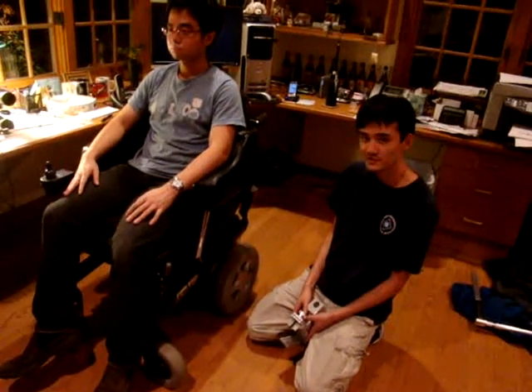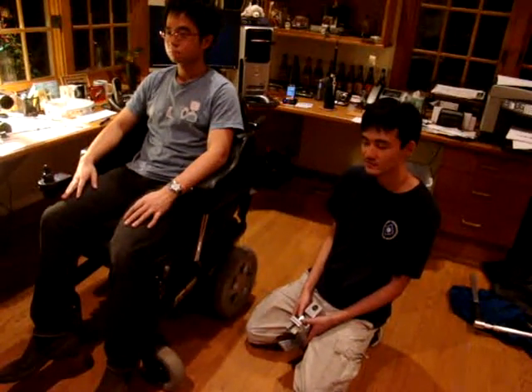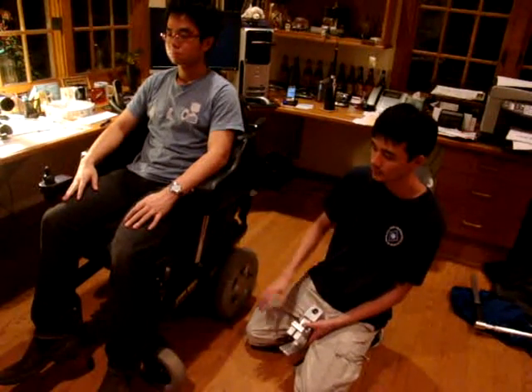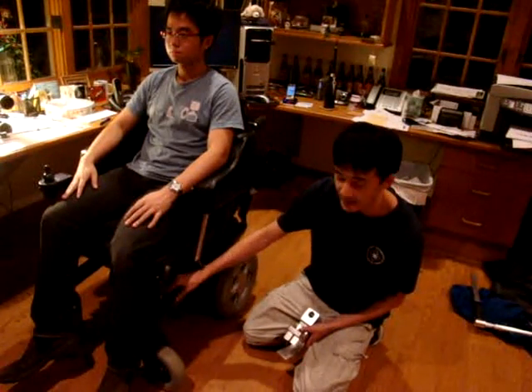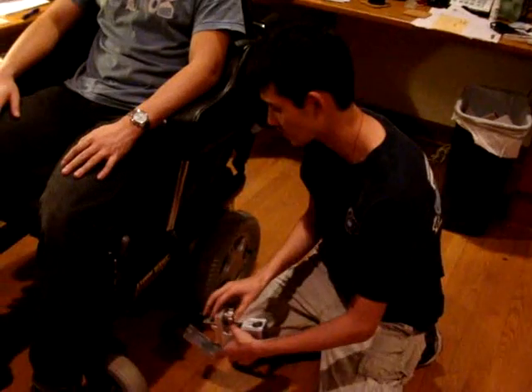In order to use the device, the first thing we need to do is attach the device to our client's wheelchair. We'll attach it to the left side, right on his base bar right here, next to the letter S. And we'll just bring the clamp around like this, and go.